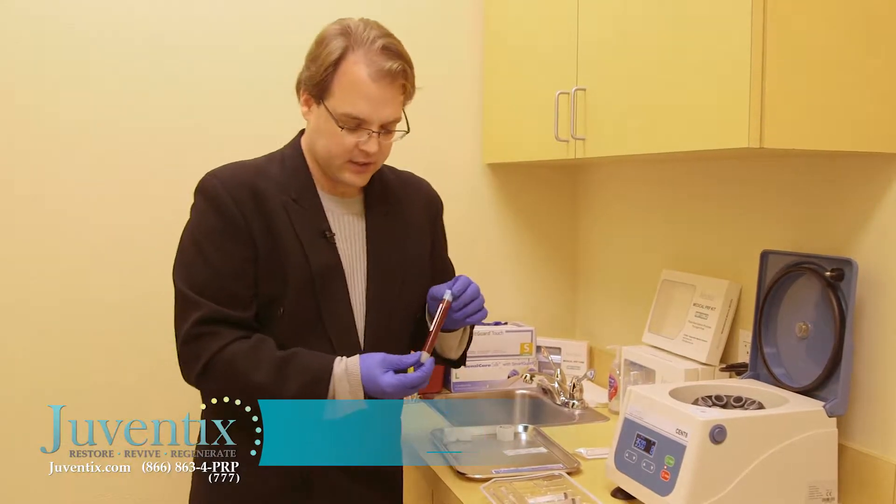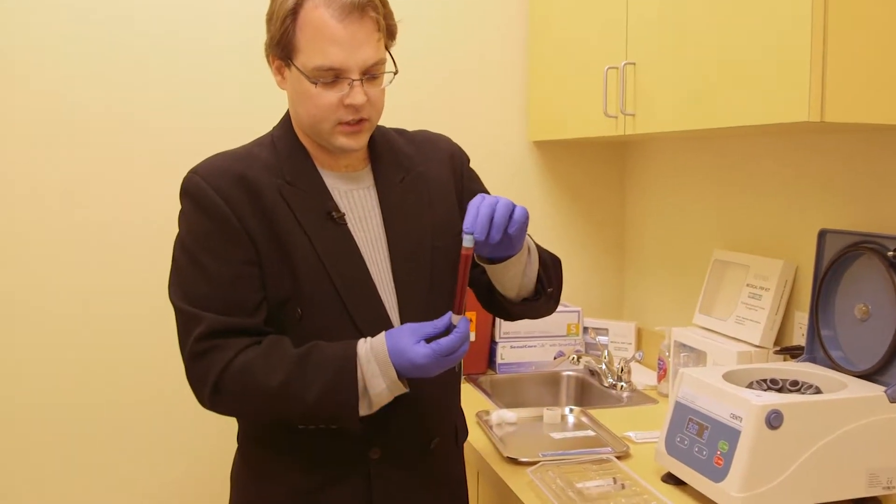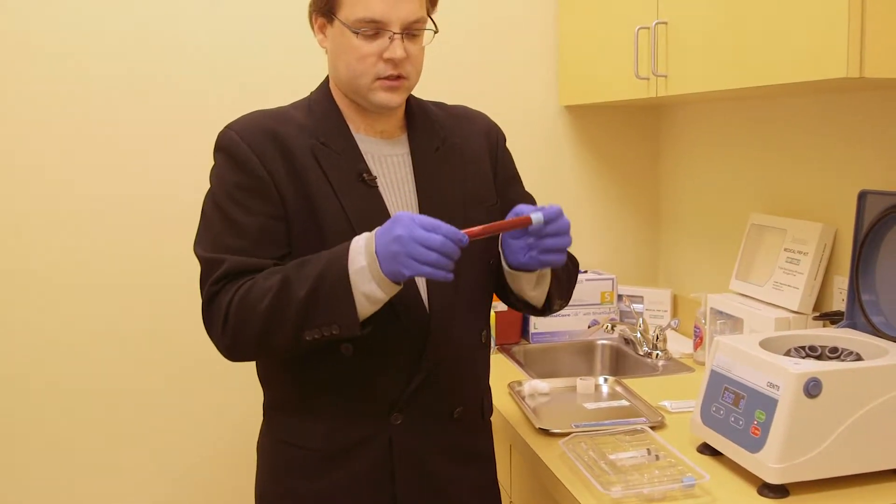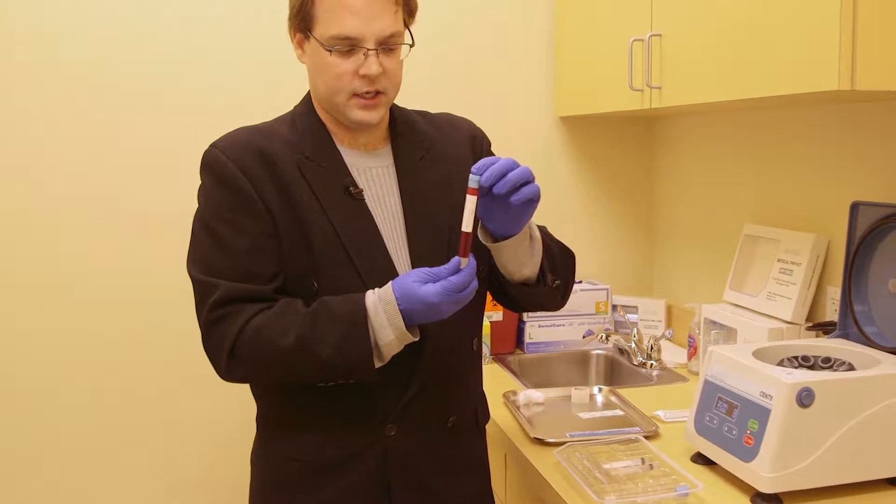We're going to take the drawn blood and we're going to invert it twice to mix our anticoagulant, our ACD, through the blood sample.